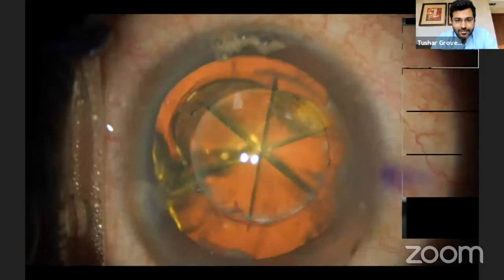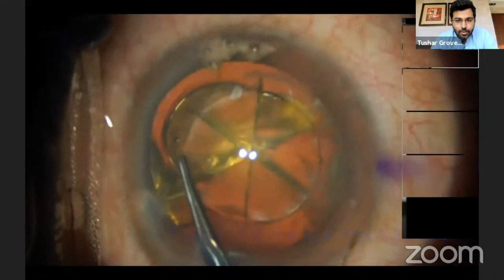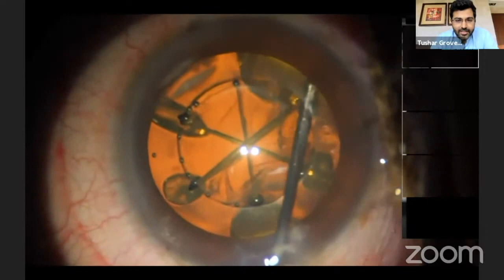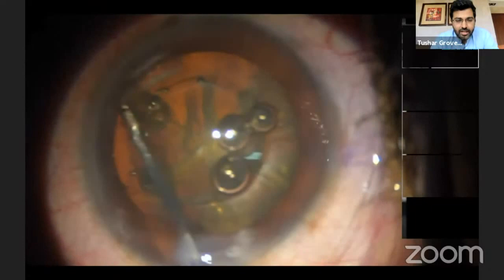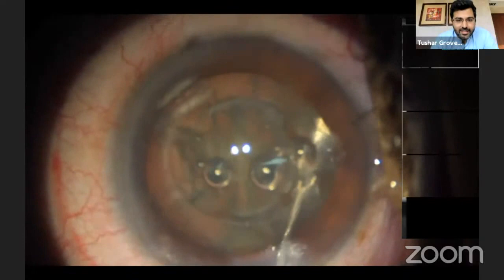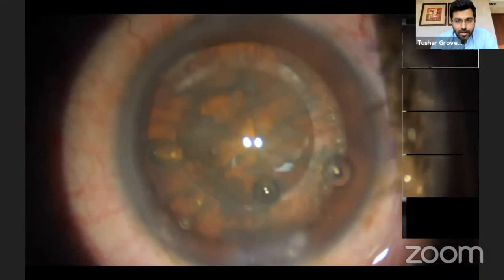It's important to be very careful with these first few steps in femtosecond laser, and it's important to remove the anterior capsule as if you were doing a manual capsulorhexis, so that in case there are any incomplete tags, you still end up with a round, circular, complete rhexis. Another initial step that's important is hydrodissection — do a gentle rock and roll maneuver to bring up posteriorly trapped air bubbles, then do a gentle hydrodissection, being more gentle than in routine phacoemulsification, and ensure nuclear rotation.